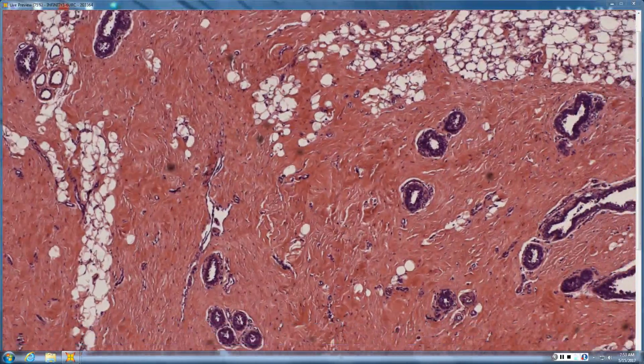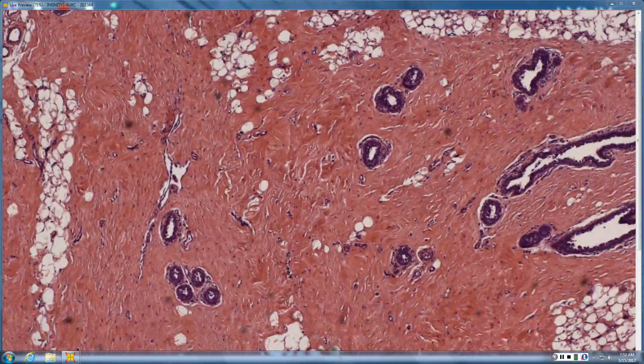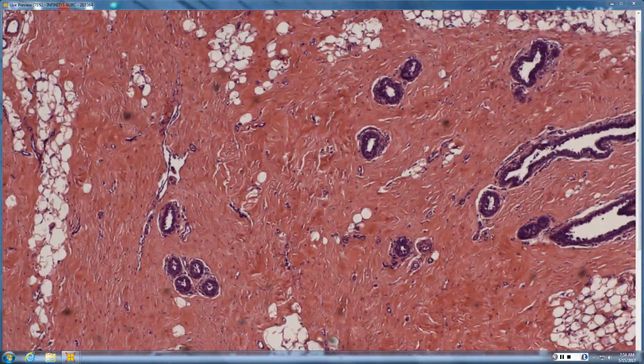So Rachel, you pointed out beautifully the glands themselves were not particularly crowded, were spaced. By background, I am a dermpath. I am not going to sign out gynecomastia on my own. I think that would be foolish, out of the zone where I should be practicing.